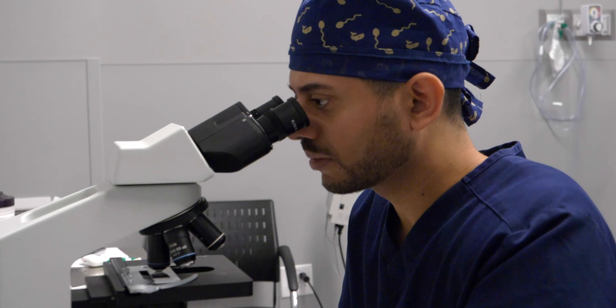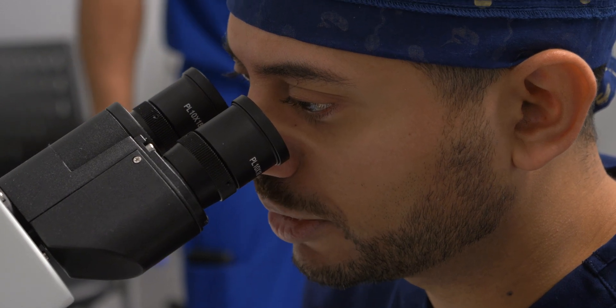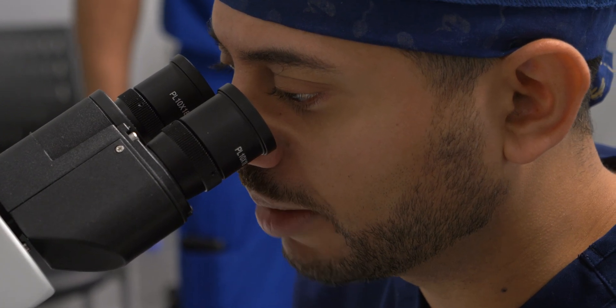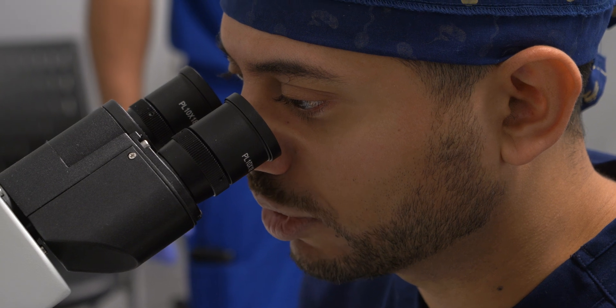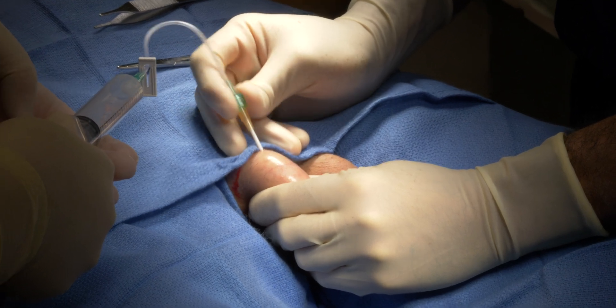We have confirmation of sperm. I am seeing sperm under the microscope after taking just the smallest tubule possible to identify and confirm sperm. I know that based on the amount of tissue I'm sending back, we're going to be okay for IVF and likely storage for multiple cycles of IVF. I confirmed that I had an adequate amount of tissue for at least several cycles.